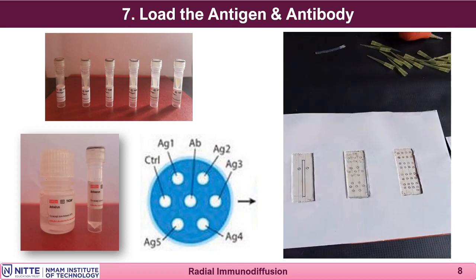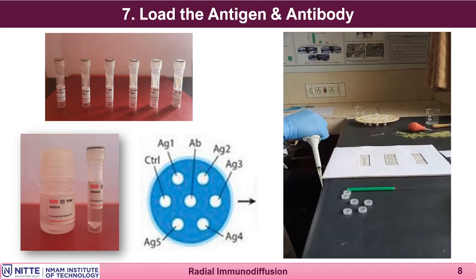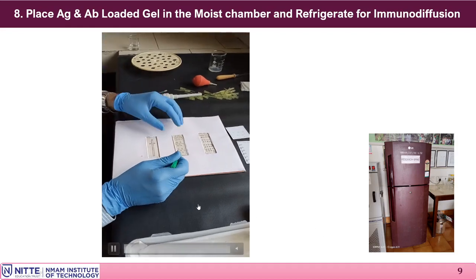Now I am loading antibody in the central well. The slide is now loaded. In the peripheral wells, antigen was loaded. In the central well, antibody corresponding to test those particular antigens has been loaded. The slide has to be kept back now in the moist chamber.